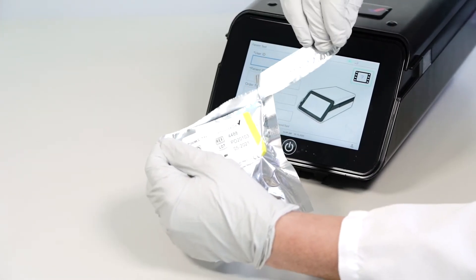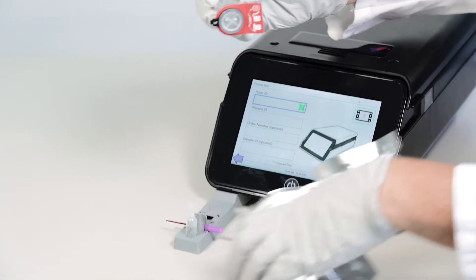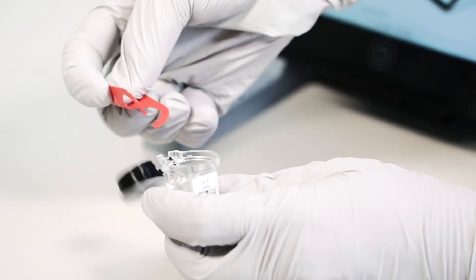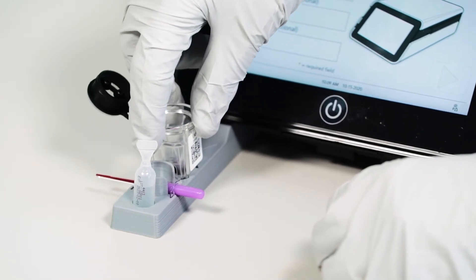For cartridge preparation, begin by opening the test cartridge packet. Remove the cartridge, then open the cartridge by pulling the red tab. Remove the tab and discard it. Place the cartridge into the Precise DX cartridge holder.